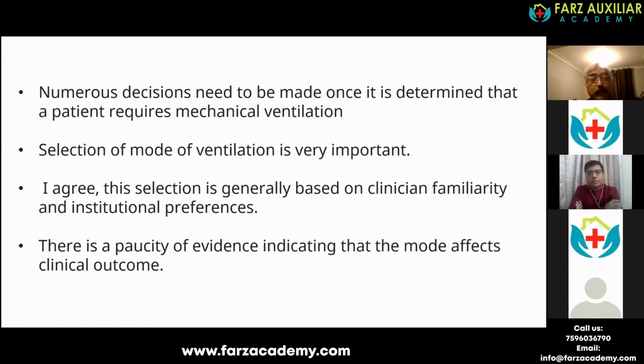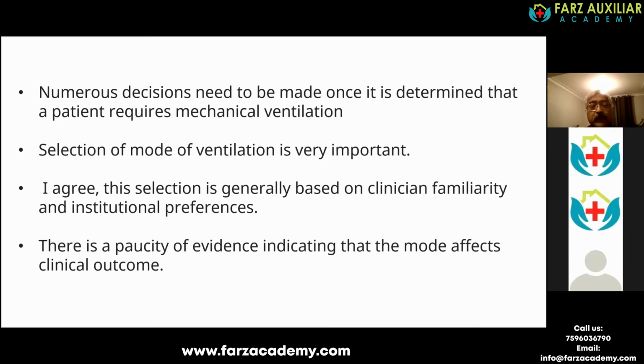Of course, the selection of mode of ventilation is very important, but I have seen that some institutions frequently use one kind of mode more than other kinds. So it all depends on clinical familiarity or institutional preferences. This is mainly because we don't have enough evidence to suggest that one mode is better than another mode so far.